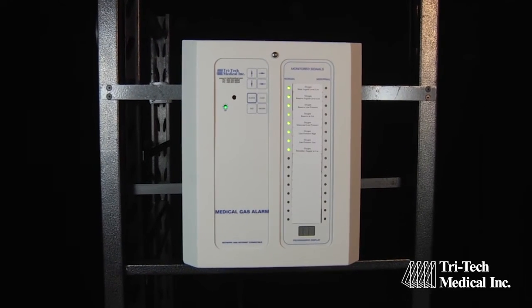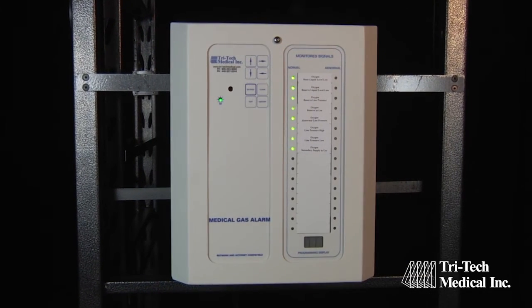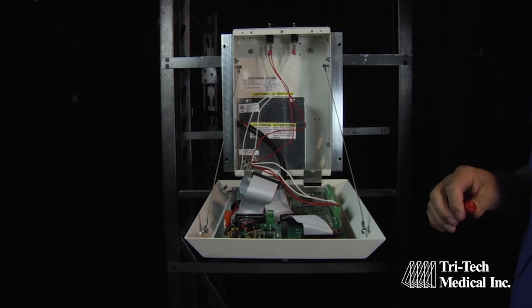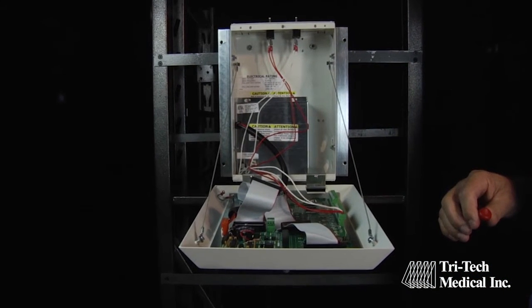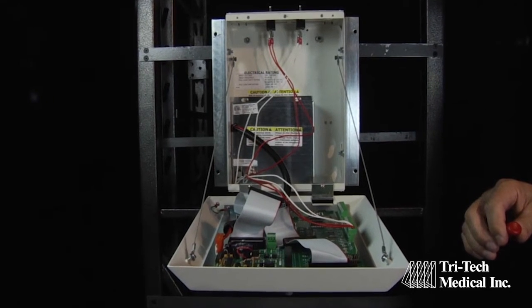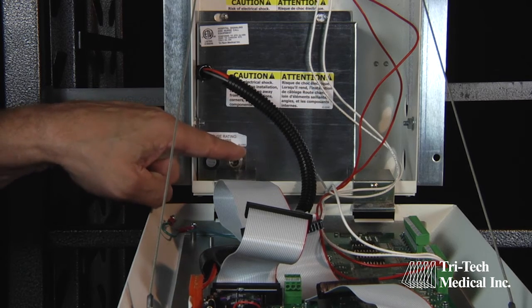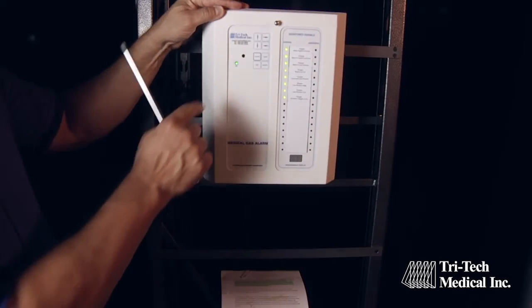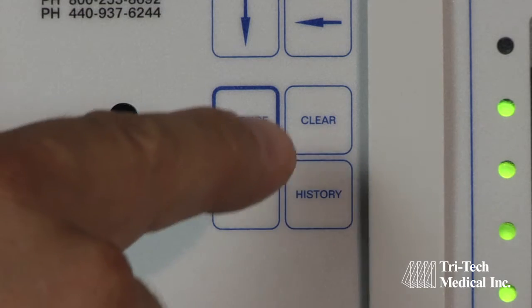When the master alarm installation and wiring are complete and the source equipment is operational and providing gas pressures in the normal operational pressure ranges, you are ready to program the master alarm signals. Turn the power switch on. If the audible alarm sounds, press the silence button on the front of the panel to silence the alarm.